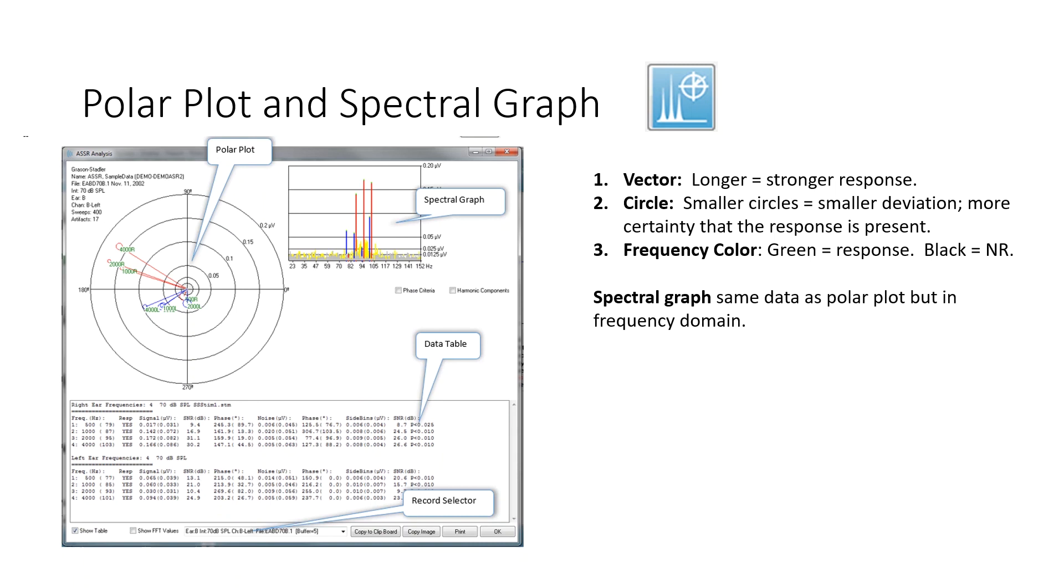So the blue lines indicate the left ear, the red lines indicate the right ear. And you can see that in the spectral graph, that the amplitude of the right ear responses are larger than the left ear responses, just as you see on the polar plot.